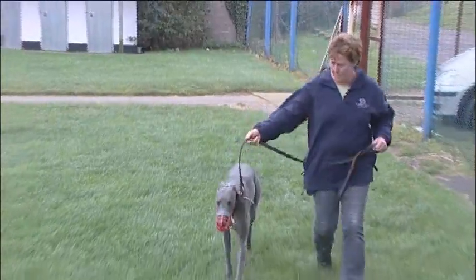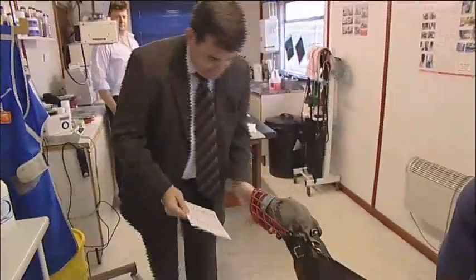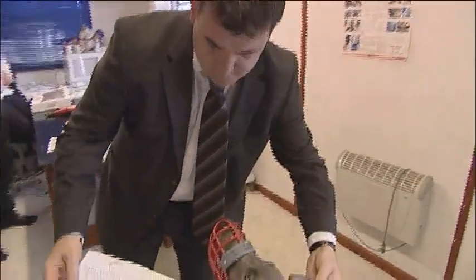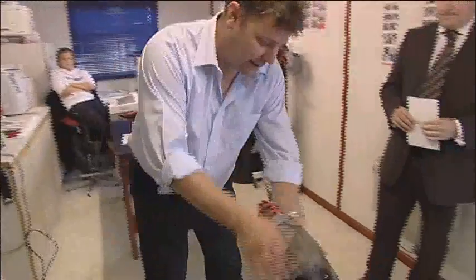When a greyhound is presented to be microchipped, please ensure that at least an hour has elapsed since its last run. The first thing we have to do is to identify the greyhound to be microchipped. This is to be done either by the paddock steward or by a Greyhound Board licensed official, using references such as identification books, stud books or a copy of the dog's markings.